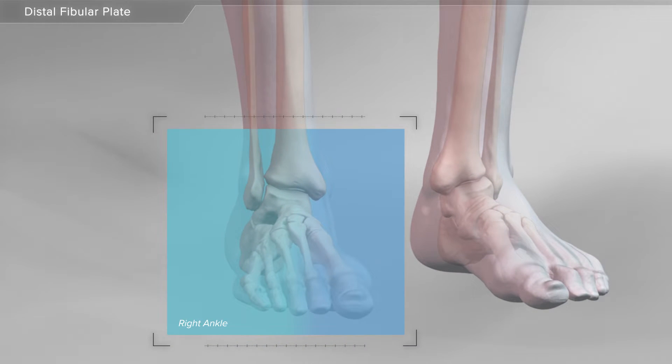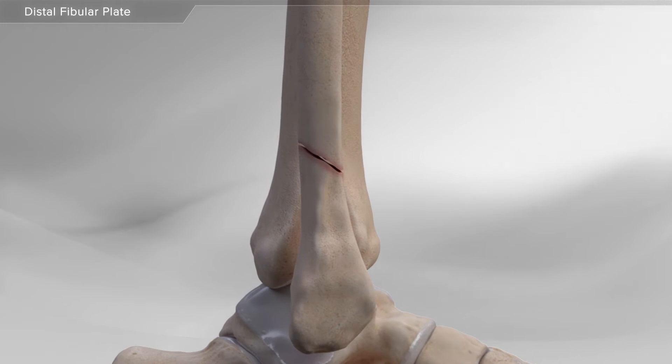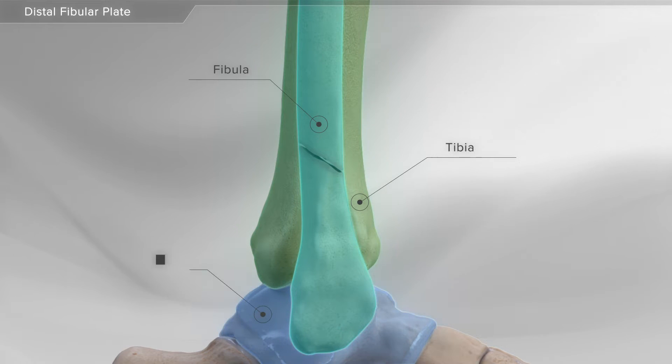In this animation, we will show an ankle fracture repair. The ankle is made up of three bones: the tibia or shin bone, the fibula or calf bone, and the talus.